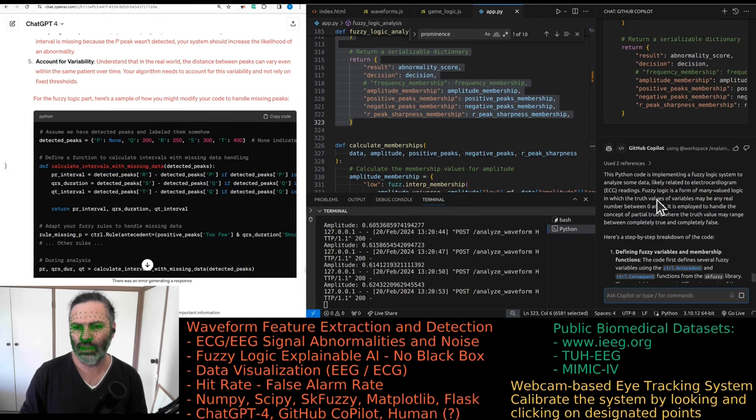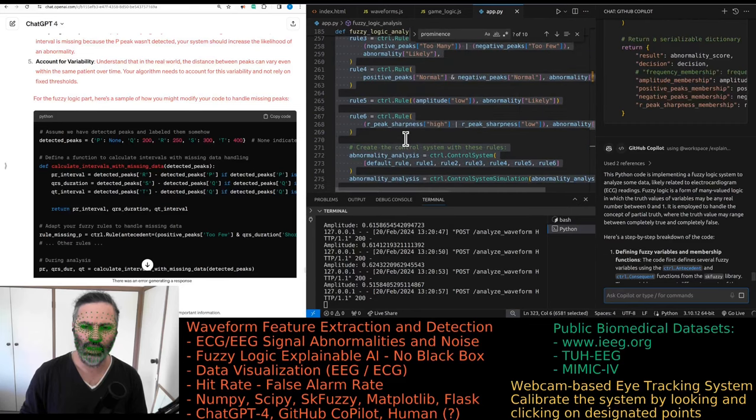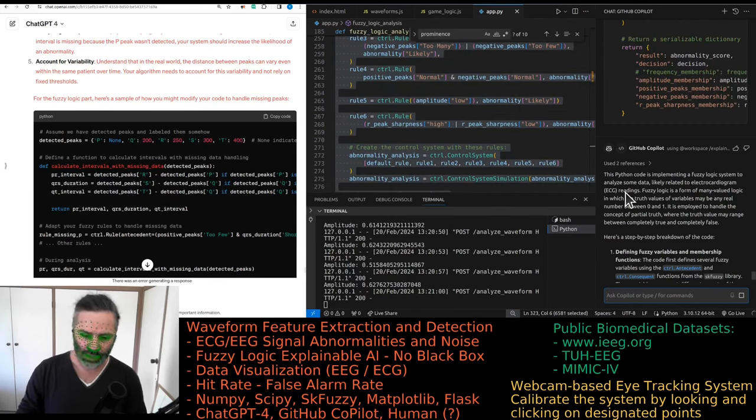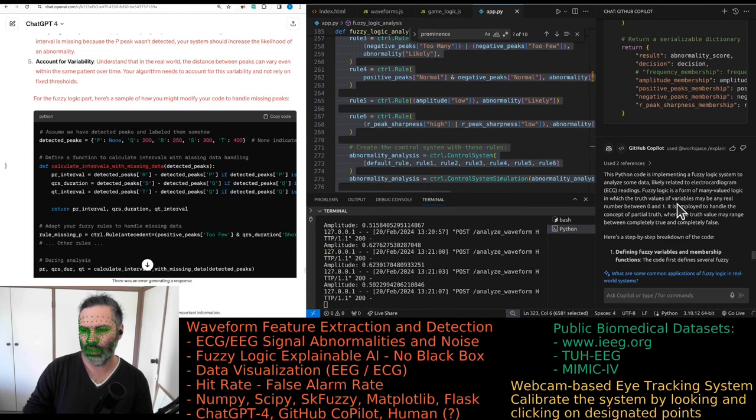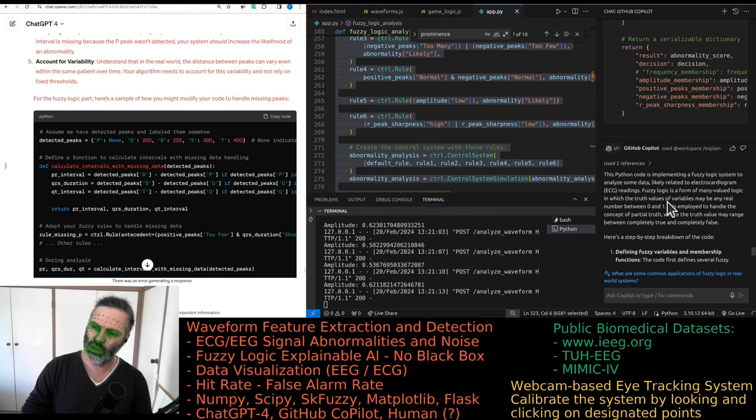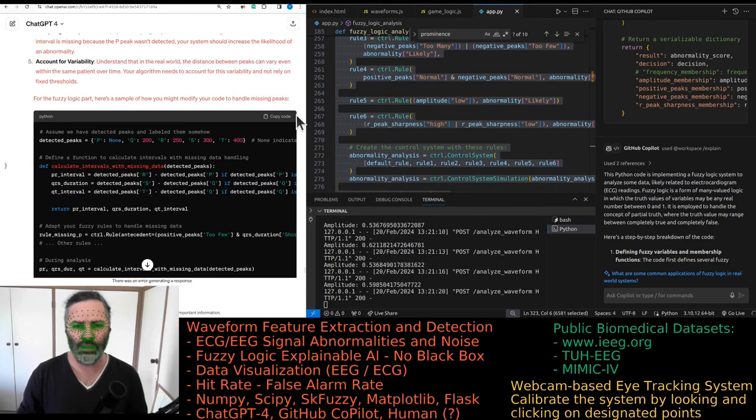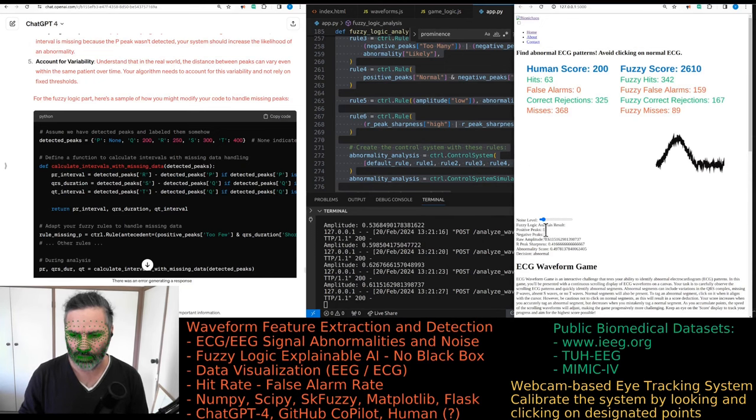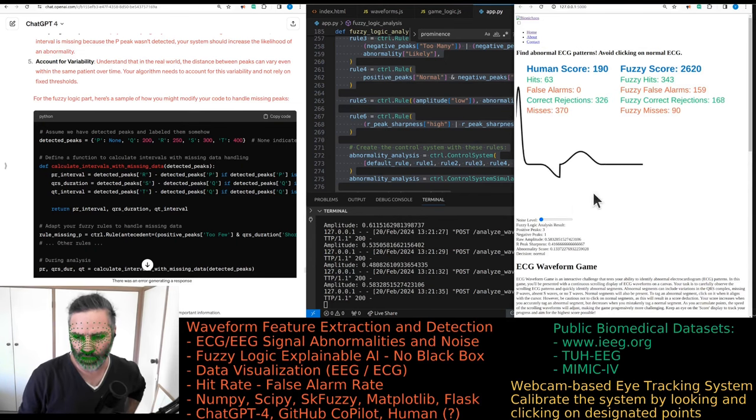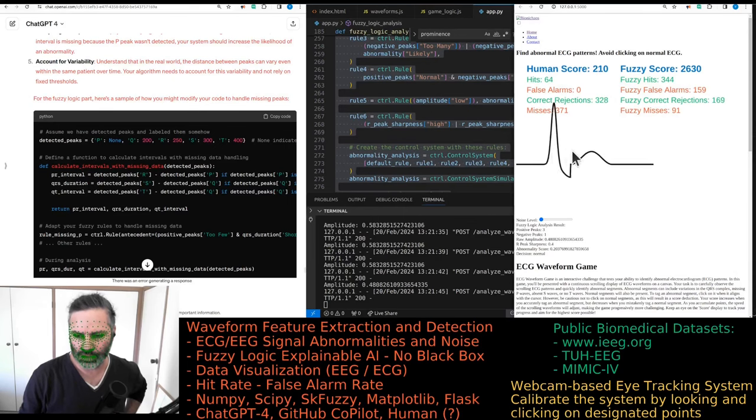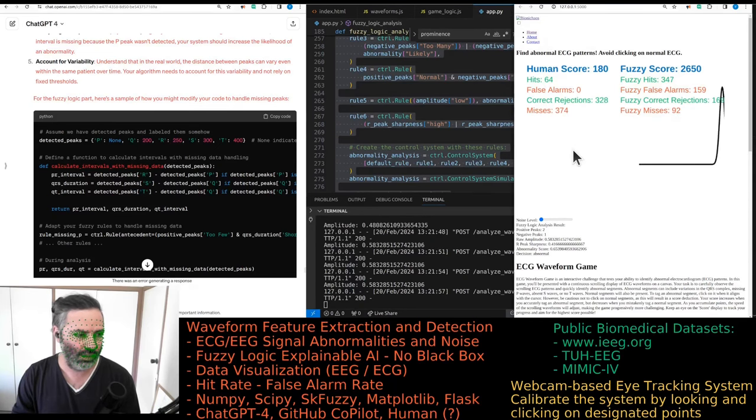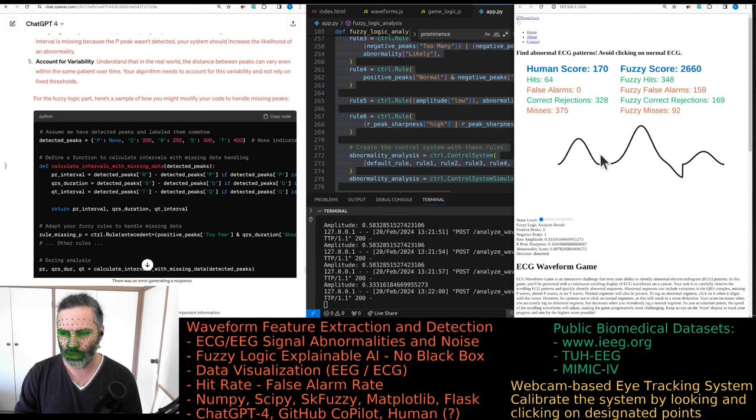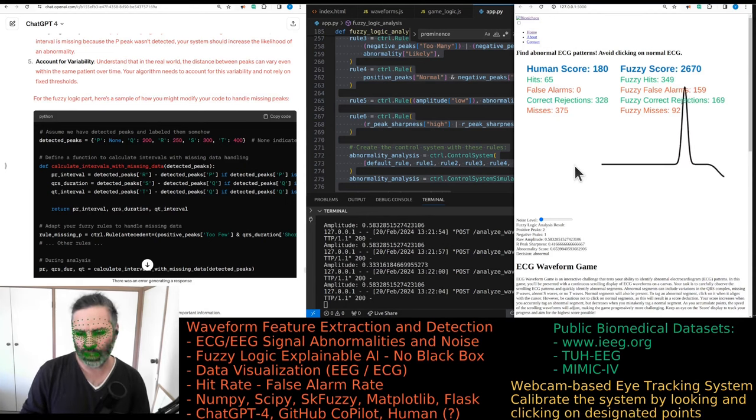It did actually read the whole thing, likely related to ECG readings. It's a form of many-valued logic in which the true values of variables may be any real number between zero and one. So all the numbers have to be normalized, which is not the case at the moment. Especially not when we have noise, then the number of positive peaks just shoots up through the roof. When we remove the noise it just gives the correct number of positive negative peaks.